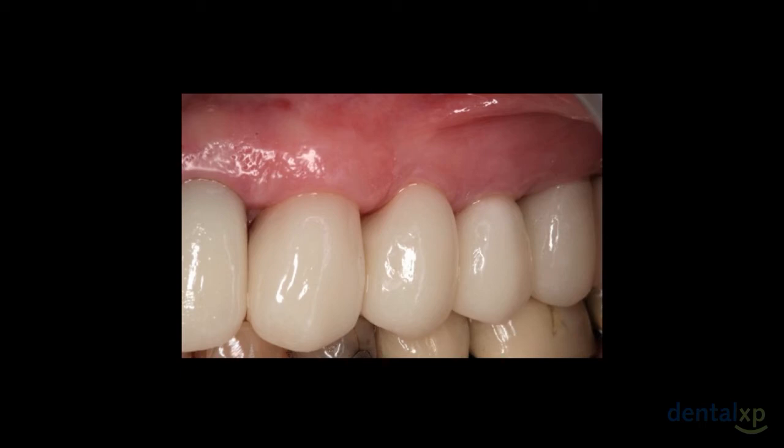I would recommend, frankly, using Emax since it will give you almost the identical result and sometimes even better cosmetics. You can talk to your lab about doing deep chamfers which run 0.5 to 0.7 millimeters, but there's no reason to do any type of shoulder or deep prep that would decrease the amount of tooth surface that we'd like to have present.